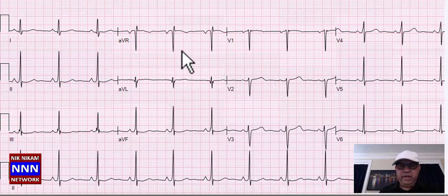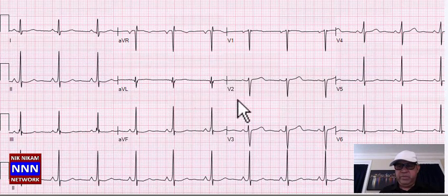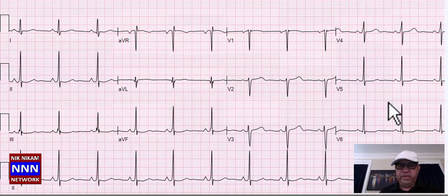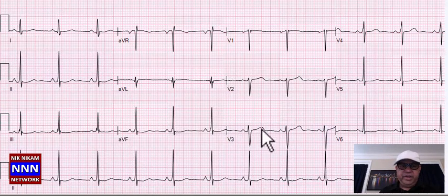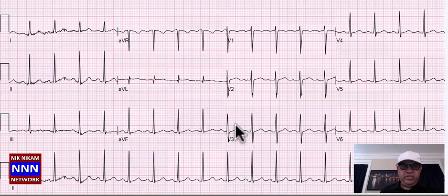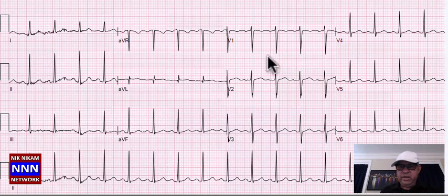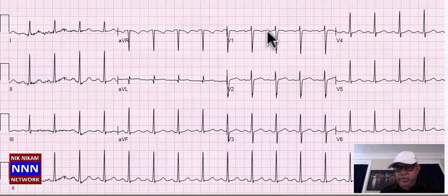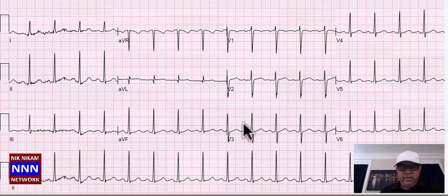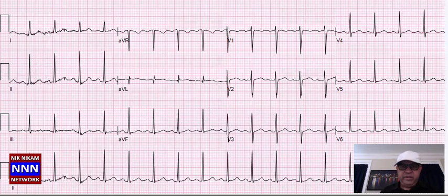Here we have a sinus rhythm — everything seems in order except for some flat T-wave changes, but nothing really strict. This is another sinus tachycardia with P-QRS combination and some non-specific T-wave changes, nothing really impressive.